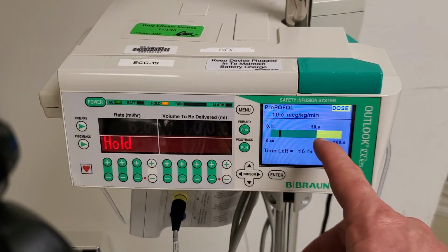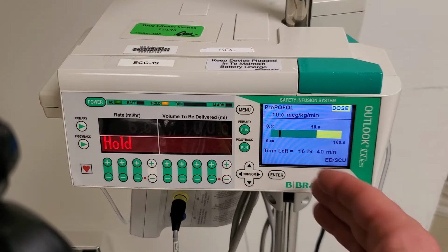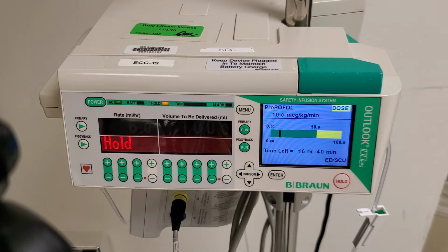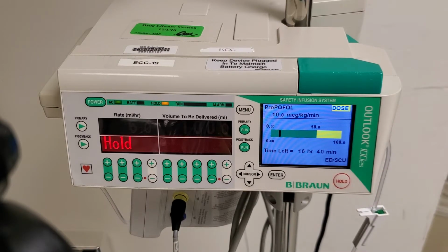Now this graph depicts the limits that are programmed into the pump. There's a soft limit of 50 micrograms per kilogram per minute. We can deliver more than 50, but the pump will give us a warning and we'll have to confirm that that's what we want to do. There's a hard limit at the high end of 100 mics per kilogram per minute. We cannot deliver more than that. The pump will tell us that this can't be done. Select another medication.